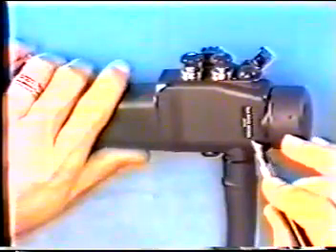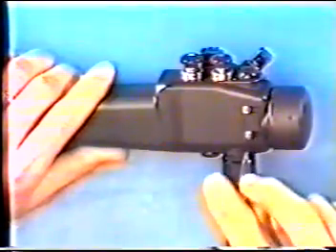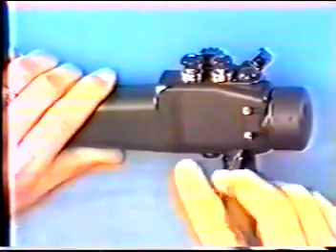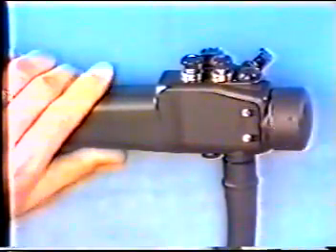Let's start from disassembly. When disassembling, be sure not to scratch the body or damage and lose any parts. Disassembly of the operating section, Part 1. First, peel off the label. Remove screws. Then, put the screwdriver into the groove of the cover and remove it.